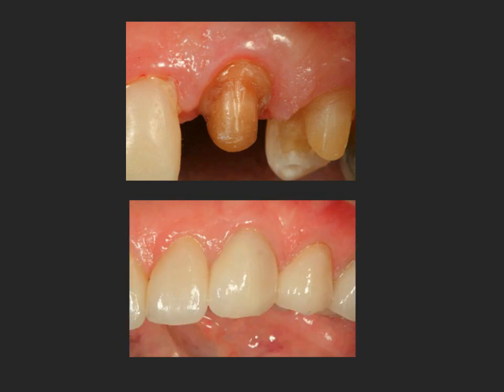The slide on the top shows a 6-month follow-up. There is a probable sulcus, and what I'm assuming would be a hemidesmosomal attachment similar to an implant. But tissue health, the tooth has been saved. A root canal was done so that there's a root fill in this tooth, and the tooth is restored. This has now been 3 years, probably 4 years post-op on this particular tooth with external resorption.